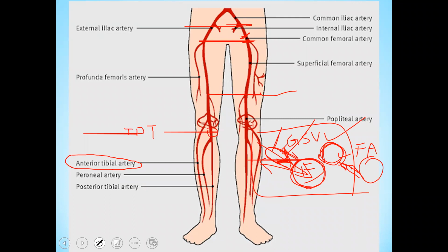So with that electronic steering, you will get an angle of insonation less than 60 degrees. And at that Doppler angle, less than 60 degrees, you will be able to predict the correct velocity.